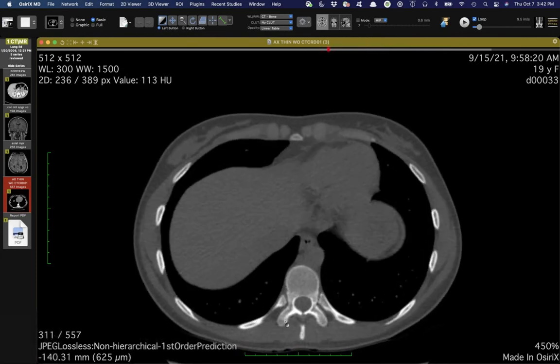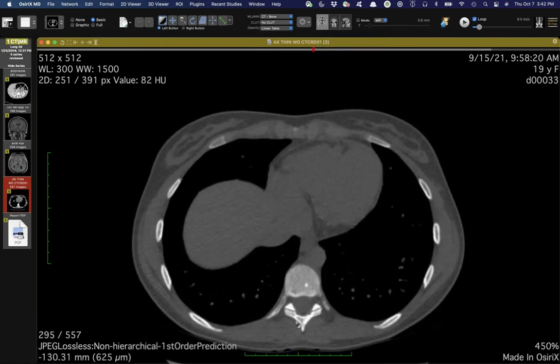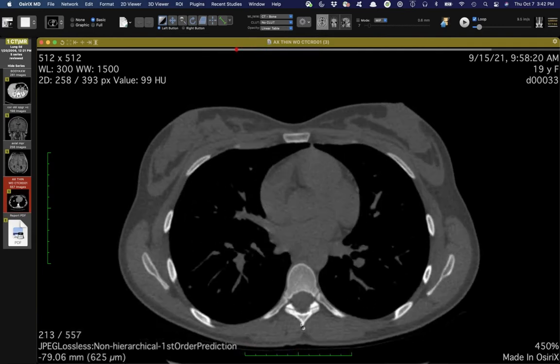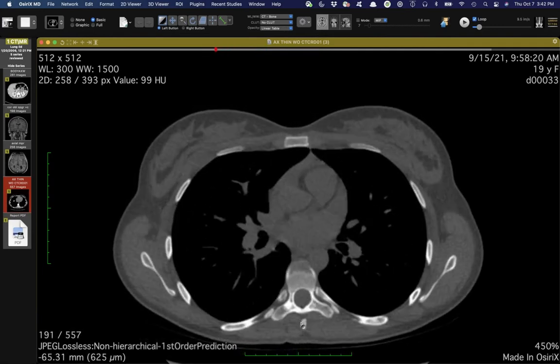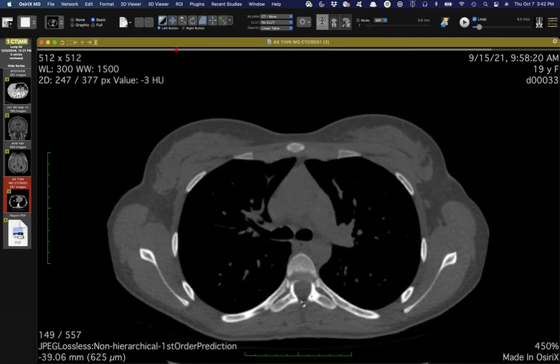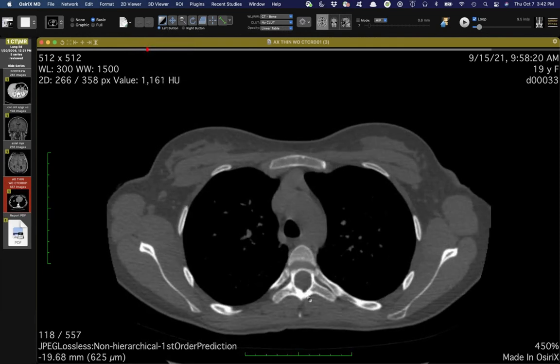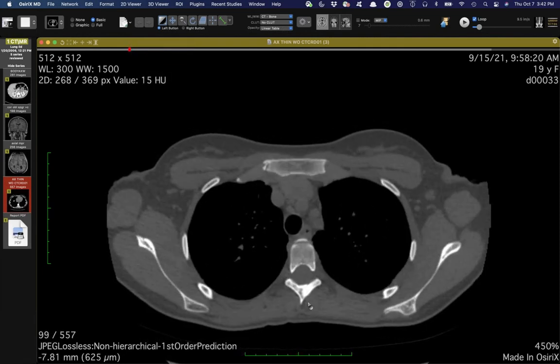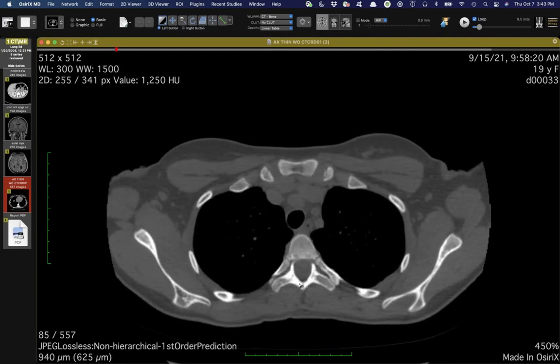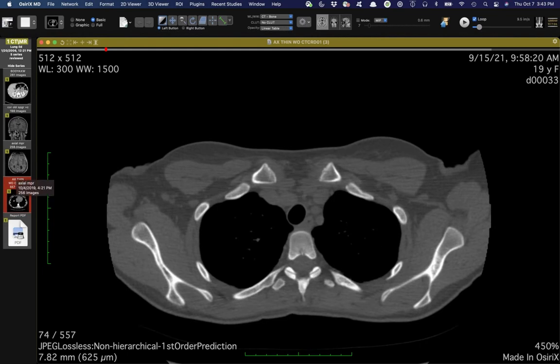There was a paper in Radiology, I think it was either 2 or 3 lesions, that if you saw them in the spine, was a fairly good discriminator of it being tuberous sclerosis complex. And she's got dozens, and they're basically just little bone islands. I was trying to look at the pathogenesis of these, and it's just some generic explanation that they derive from neural crest cells, just like all of this other stuff. So I don't know, but these are all findings that can be seen.